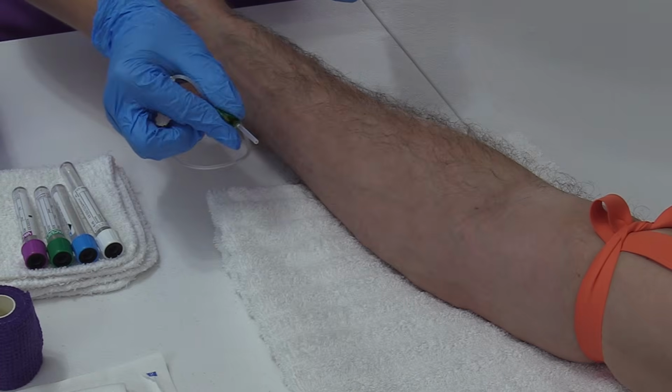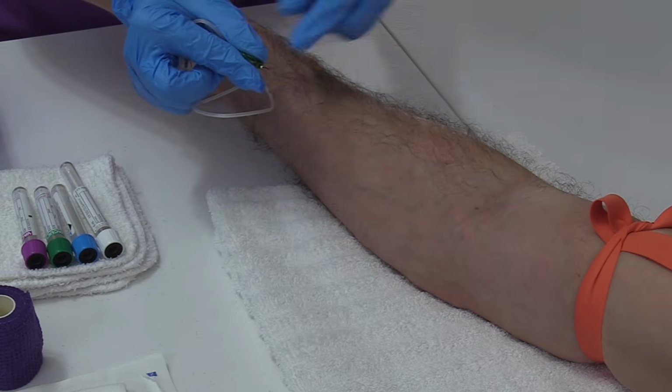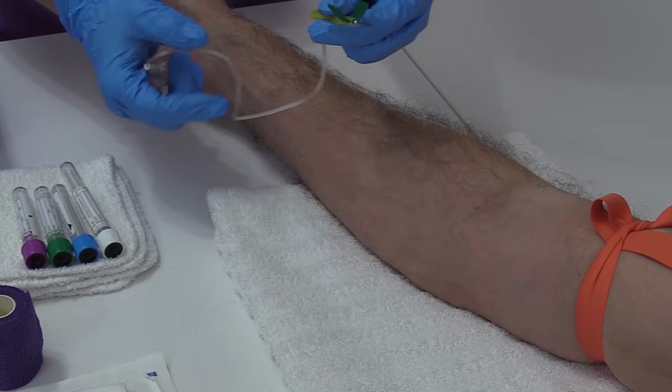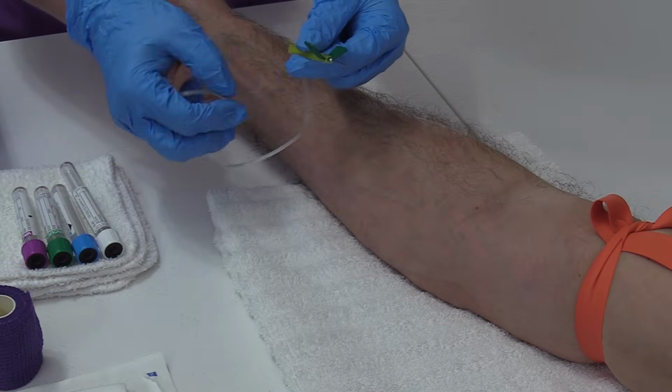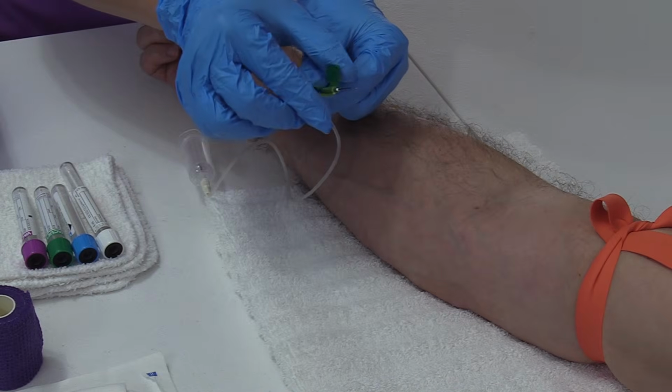I have my butterfly collection set. I'm holding it by the textured wings. I'm going to remove the sheath. And you want to make sure your tubing's uncoiled and you have your holder. You can keep it in your hand like this, or you can lay it next to the patient on a clean surface. It's whatever you prefer.